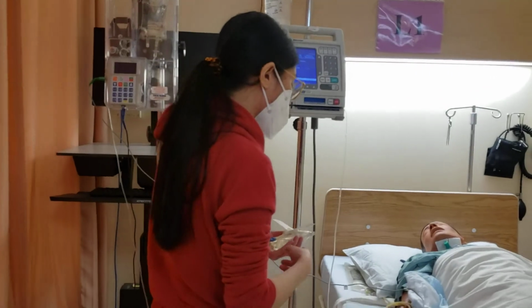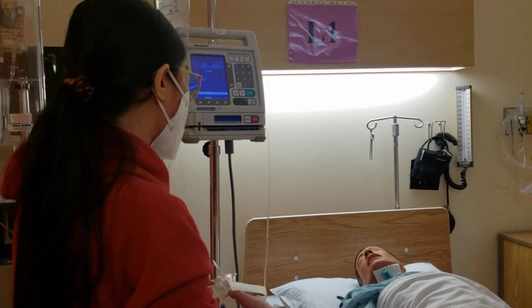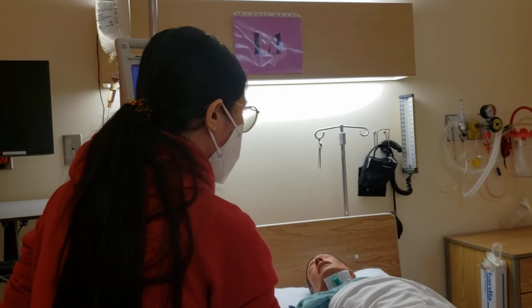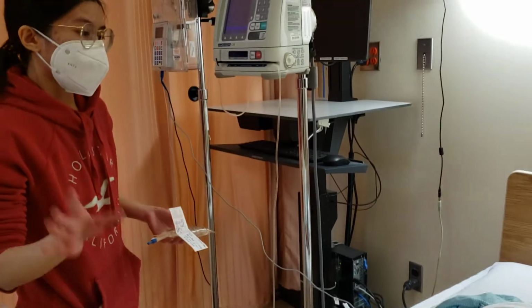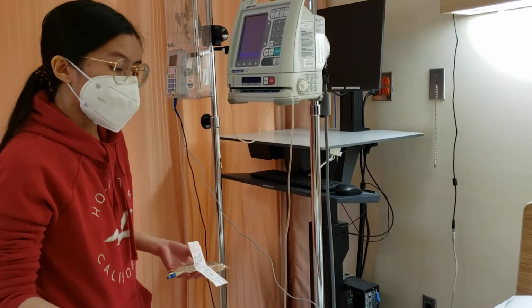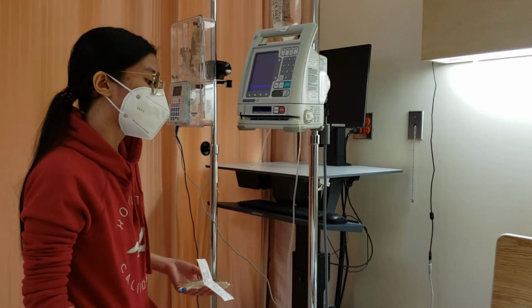Mr. Tyson, your doctor has ordered for you PCA, or pain medication for you. This medication, you can use this button. Once you hear that beep, it means it has infused in your system, and then you can get your pain medication. And you have to wait for about 5 minutes or so to get another dose of that medication.